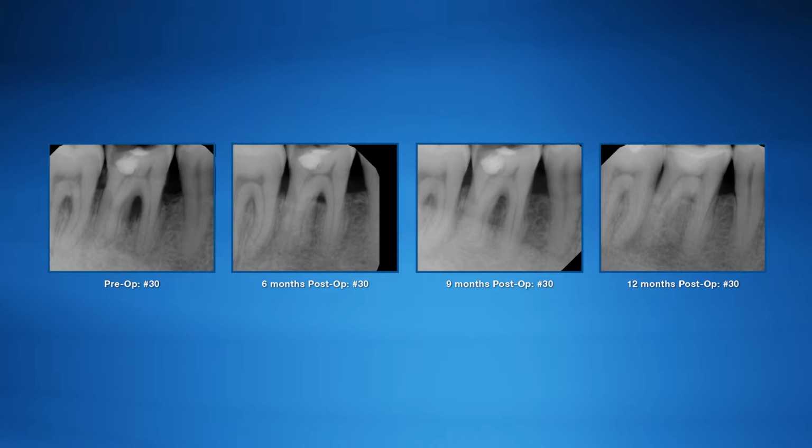It's actually very important for the furcation to fill with bone, because if not, it's hard for the patient to maintain them. At this point, the patient is gum disease free now. We probed, and there was no deep pocket at all. It was like it was never there.